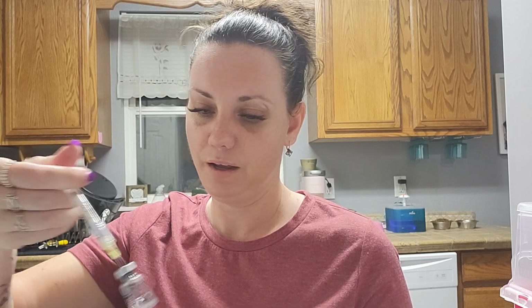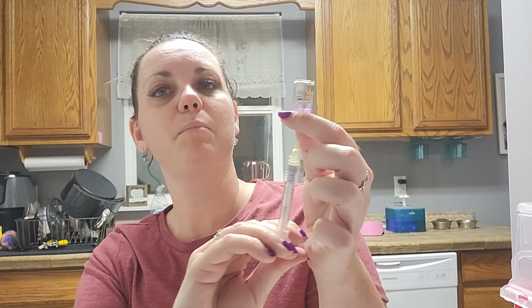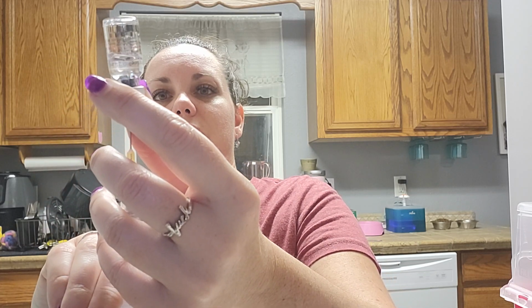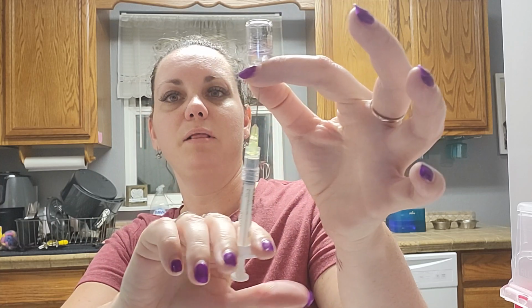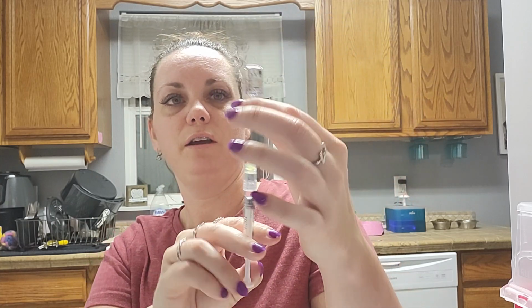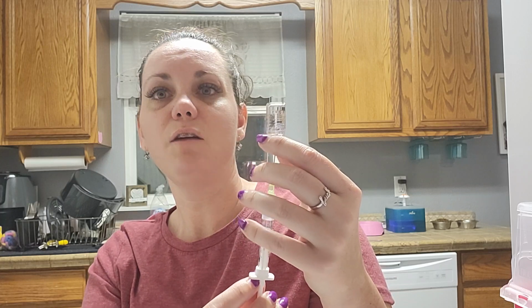And then flip it upside down like so. Pull your needle, the bevel of your needle down like so, because once you let go of the plunger, it's gonna fill back up in the syringe. So we always want to make sure that the needle is below the level of the fluid, so that way, again, we're not getting any air.